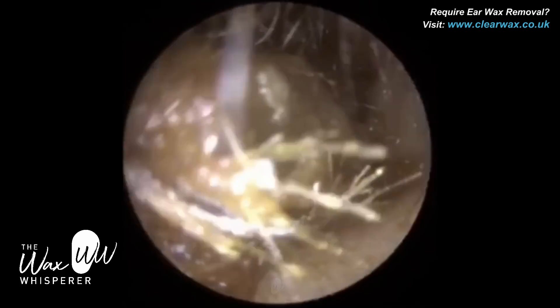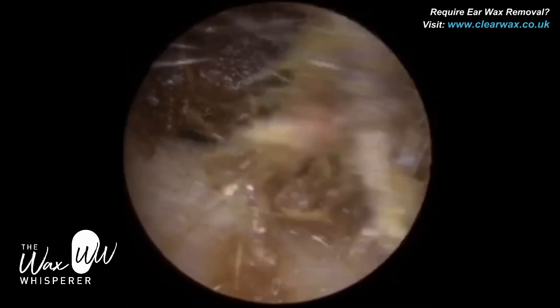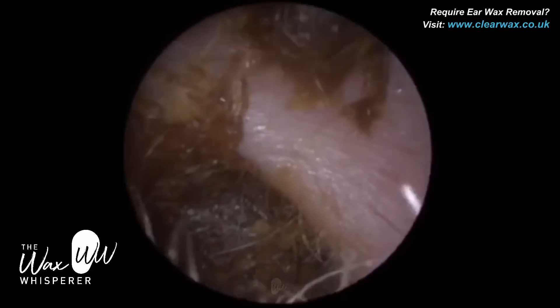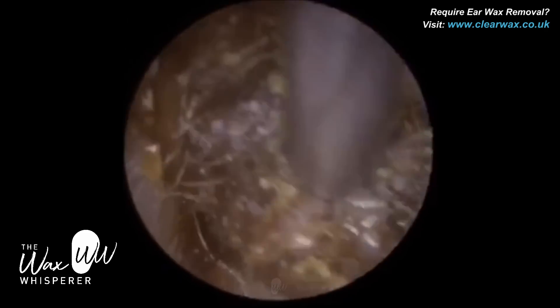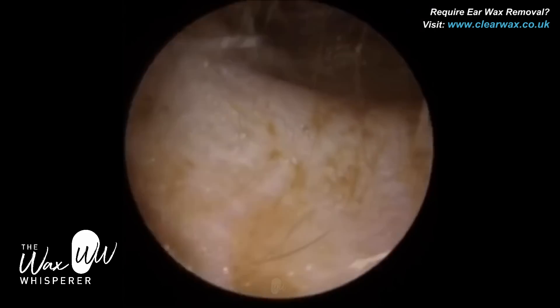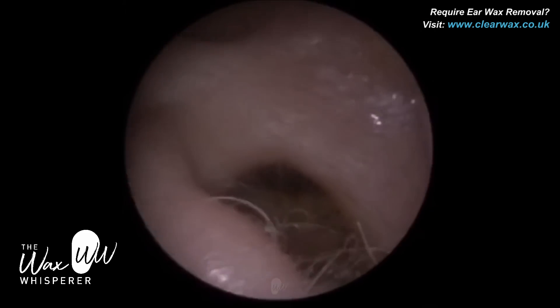So it is a bit sticky, and I'm just manipulating this wax, bringing it forwards and backwards, rocking it, trying to tear this piece of wax into a segment to release it. And that's also brought some more medial wax forwards as well, and that got trapped near the entrance. There is a layer of keratin that's just engulfed and enveloped this plug of wax. You can see some of this residual keratin that's in the ear canal.